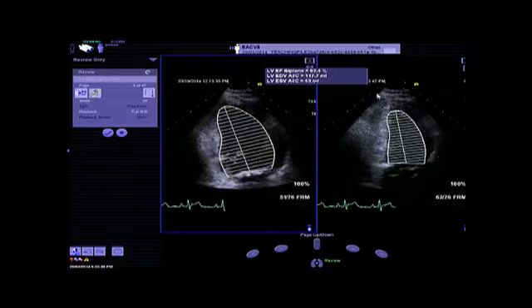And with the 2-chamber view, you can see that the biplane ejection fraction is 62%, meaning that we are still in the good normal range of ejection fraction in this kind of patients. But to be honest, I would have expected at least 70%, because 62% in presence of mitral regurg is maybe already a sign of some degree of LV dysfunction.